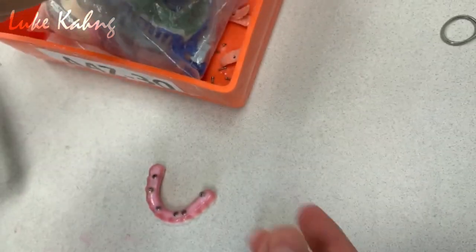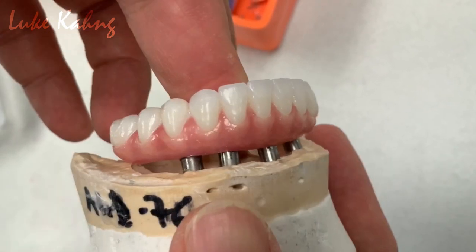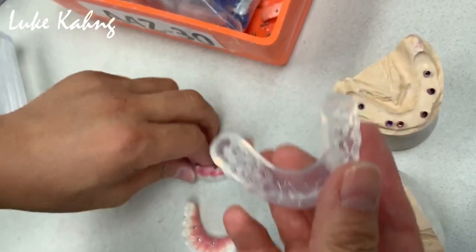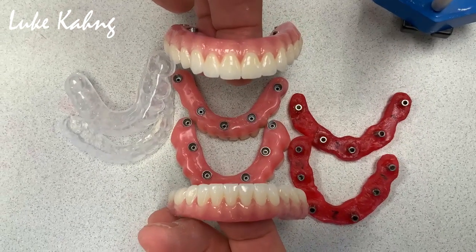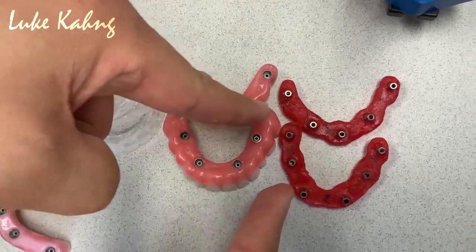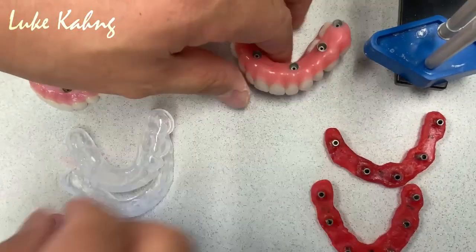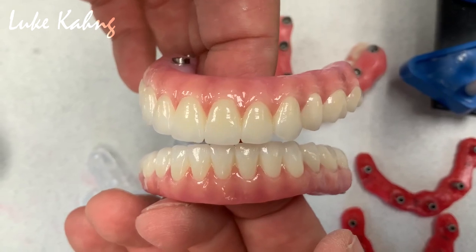And here's the lower implant, which is put together. Okay, and then here's the upper and lower. And also, we give them this soft stent. Okay. All right, beautiful. That is another great Saiten 4500 signature line case. Great job, the verification jig. Wax try-in, finally, because they finish it, beautiful job. This is our job, finished, improved to the highest aesthetics.